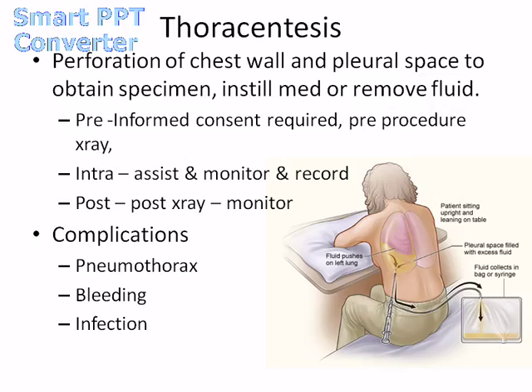Sometimes as we age, the changes in where our fat is deposited in older adults can make it difficult for the individual to find landmarks to insert that thoracentesis needle. So ultrasound is the best way. We want to make sure the patient has an informed consent, and we want to gather our supplies. Typically, you will find a thoracentesis tray on every cart in every unit. So you want to be familiar where that is.